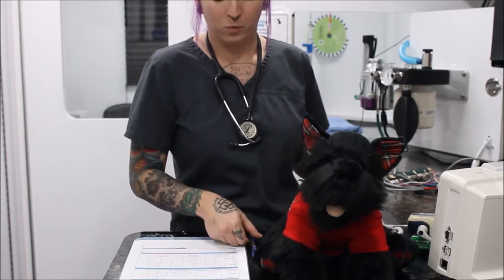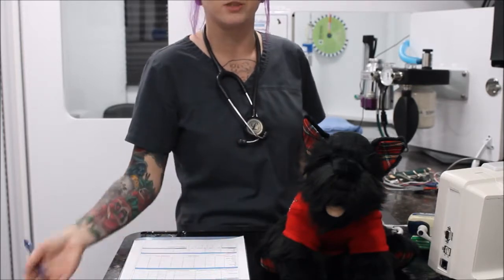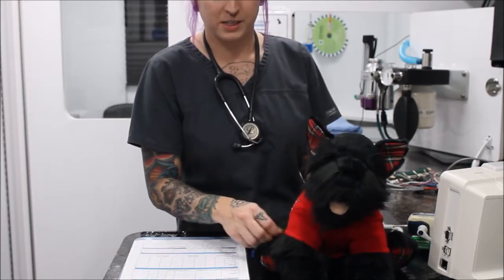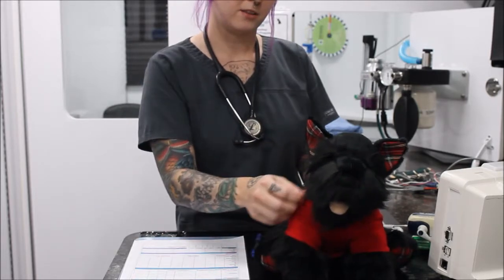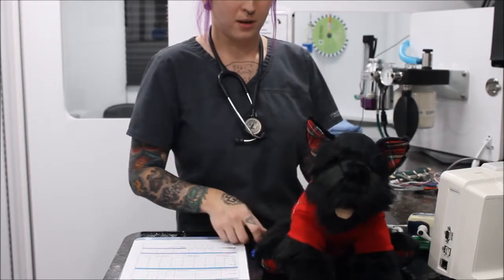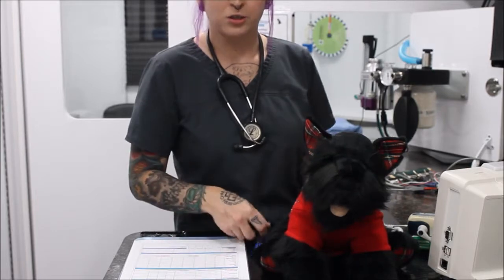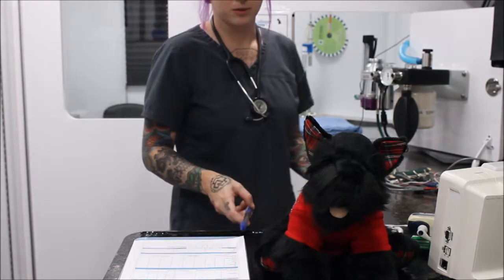Again, most of the time we do monitor mucous membrane color before we put them under anesthesia, but some things can change, such as if they were to go into shock or start losing a lot of blood, then we would know. Another one we want to look for while they're under anesthesia is if they're turning blue at all. Blue would be cyanotic, which would indicate that they're losing oxygen, or they're not getting enough oxygen to their system. So those are really important to look for. Another one is if the gum color or tissue color at all is yellow. Usually, again, we'll notice that before we put them under anesthesia, but that might indicate some kind of liver problem.